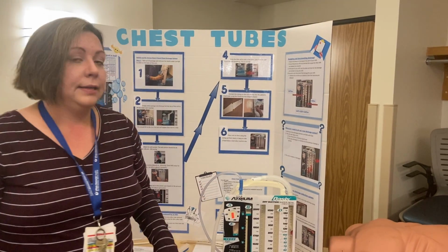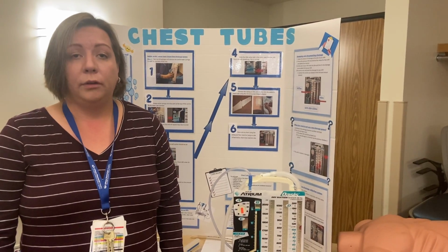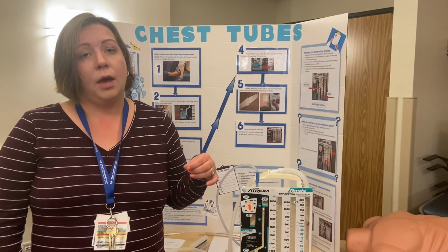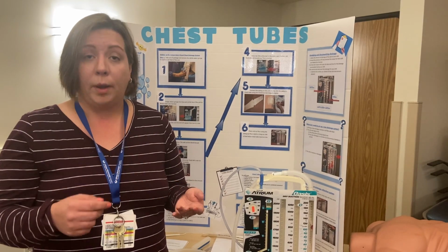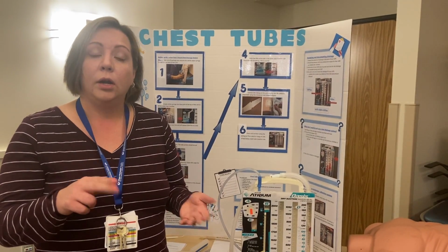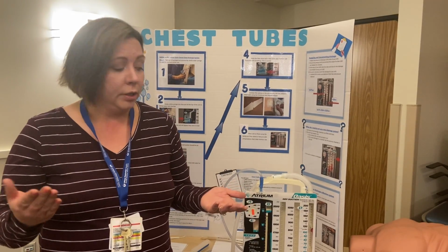You also want to assess the dressing every day. You want to do daily dressing changes, and the daily dressing changes do not include the Xeroform. They just include the gauze, the Tegaderm, and the tape. And assess that site. You want to kind of feel around that site to see if you're feeling any crepitus. That's that air trapped under the skin. And if you are, you want to make sure if that's a new development, you're notifying the doctor.